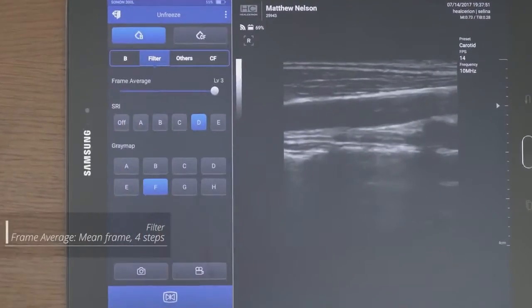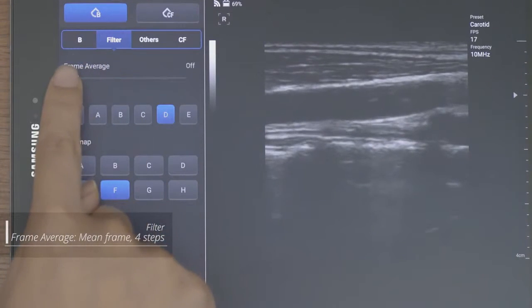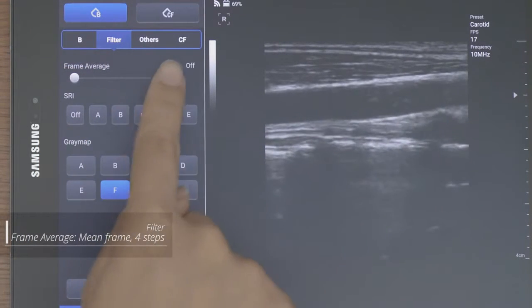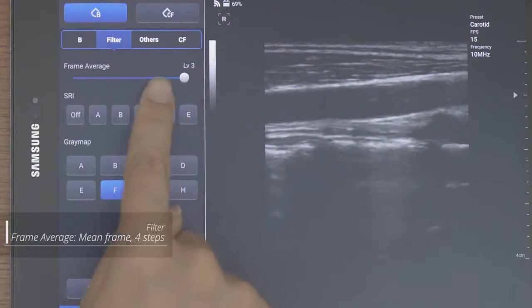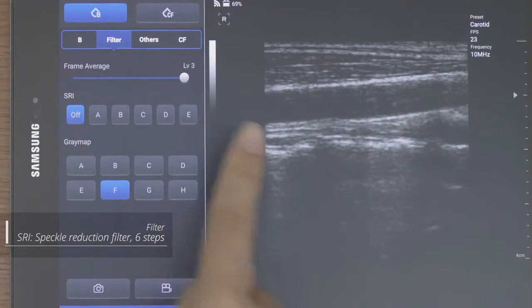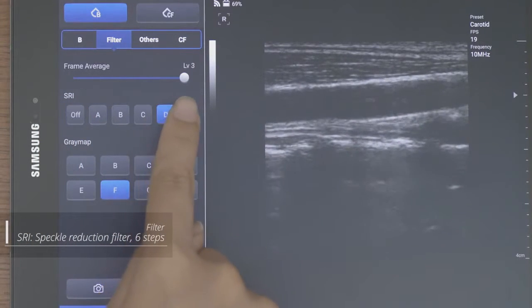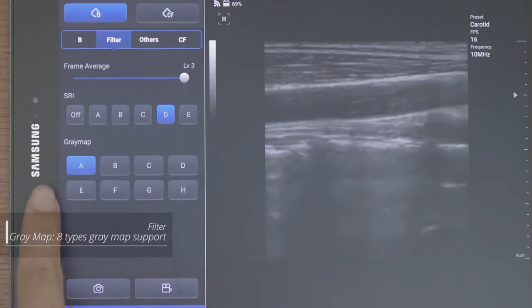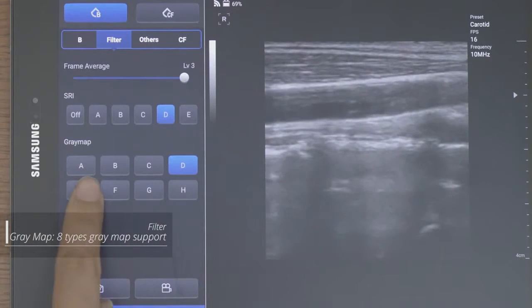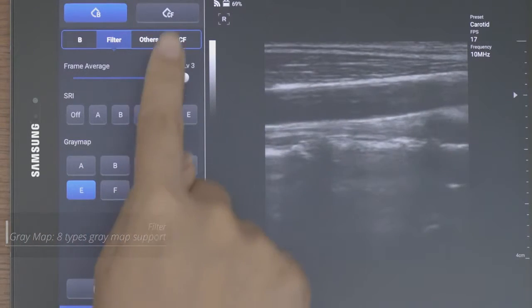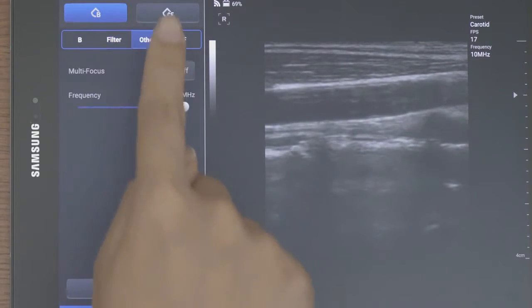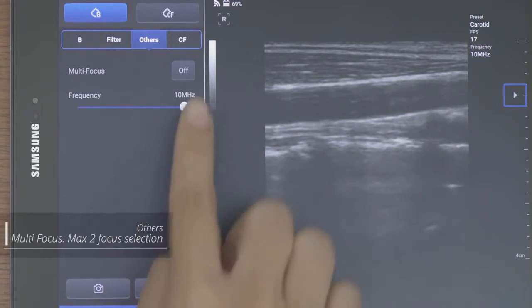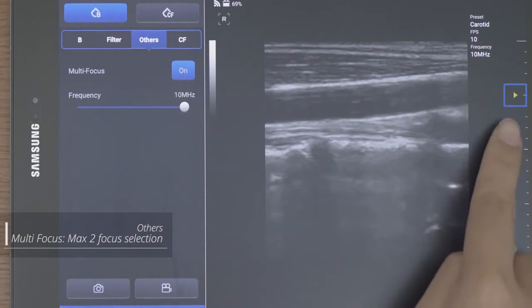Frame average, SRI, and grey map can be set in filter settings. Multi focus and frequency also can be changed in the others.